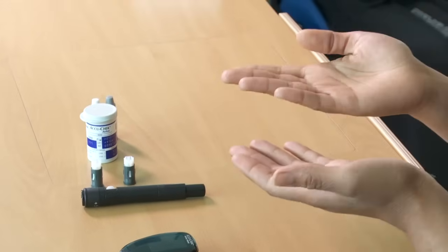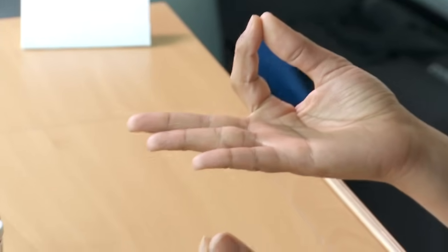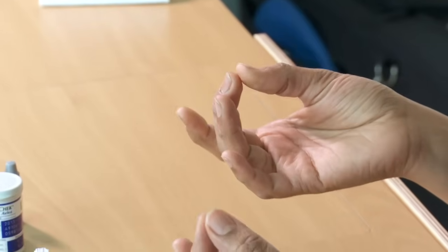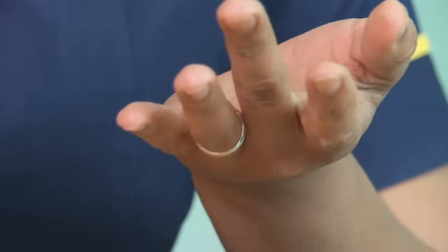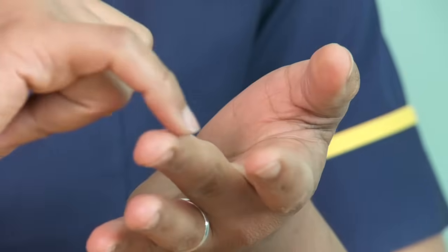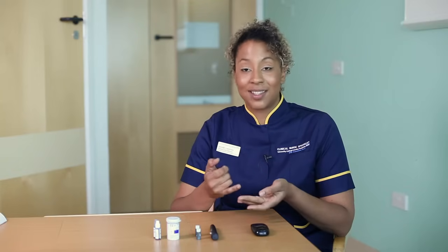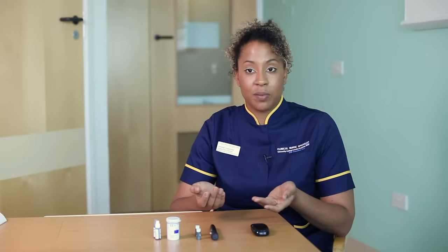Thinking about where we're going to prick — we try to avoid the pincer fingers, as we preserve these for fine motor skills. That leaves us with three fingers that we can use. As far as possible, we try to avoid the pads of the fingers because there are lots of fine nerve endings, so we try to prick around the sides. Obviously if the child is very small it doesn't leave you with much space, so don't worry too much — just do the best job that you can.